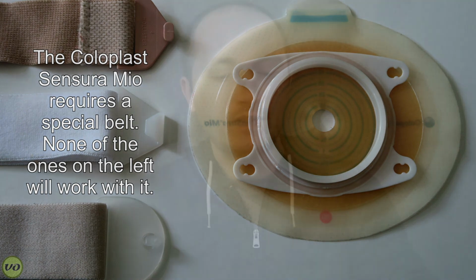The good news is accessory belts tend to be pretty cheap. For the most part, you're looking at $10 to $15. And that could be Canadian or US, they're not that expensive. And also insurance tends to cover these.